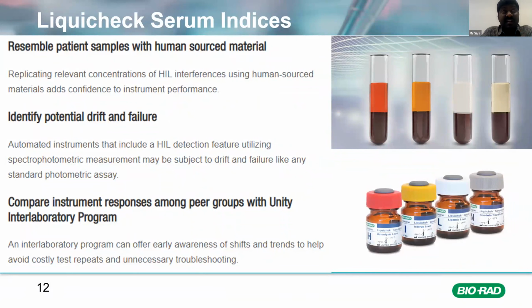By running this before running the patient samples, it works as an effective quality control system, showing how good your system is at detecting interfered samples. As we know, patient samples are normally considered blind samples, so we have nothing to refer to for the patient samples unless you are analyzing through the naked eye.